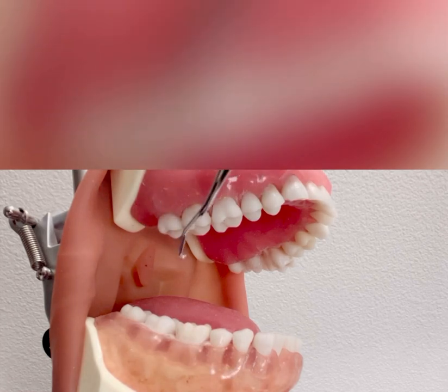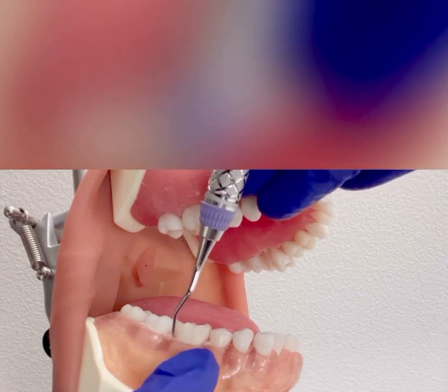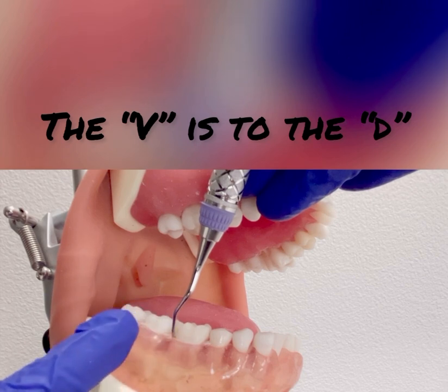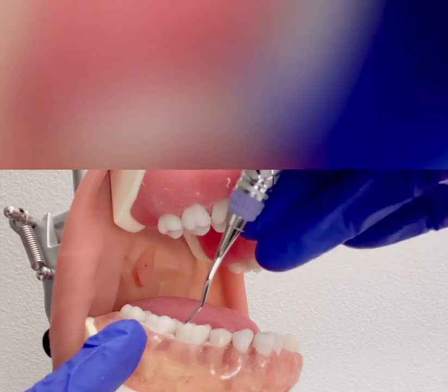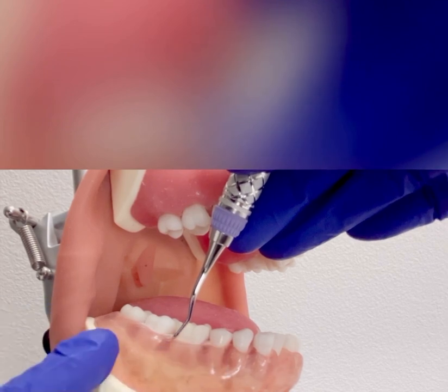You can also find the correct working end by holding the instrument to the distal of the tooth you are going to scale. You can see that the V in the lower shank, or that bend, is pointing towards the distal, which is the correct working end. If you flip it to the opposite end, the V is now pointing towards the mesial, which is not correct.